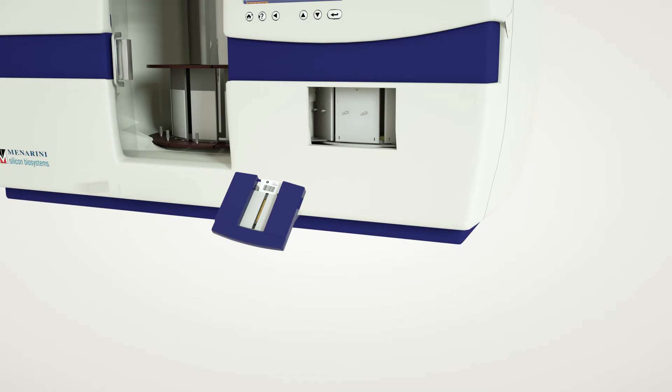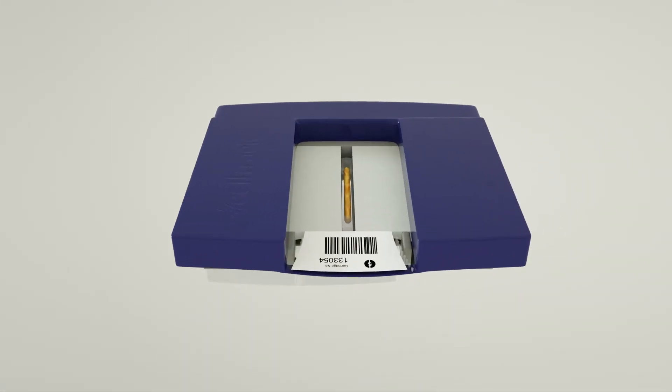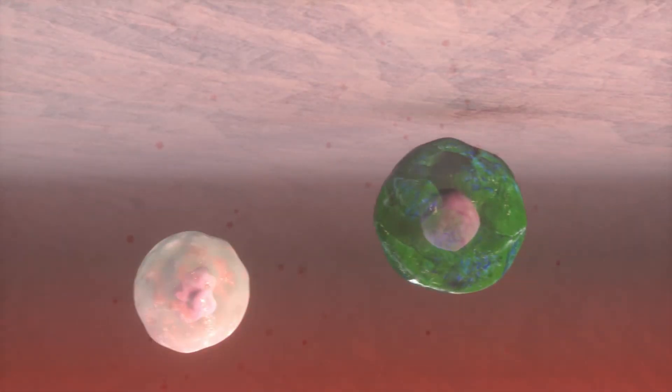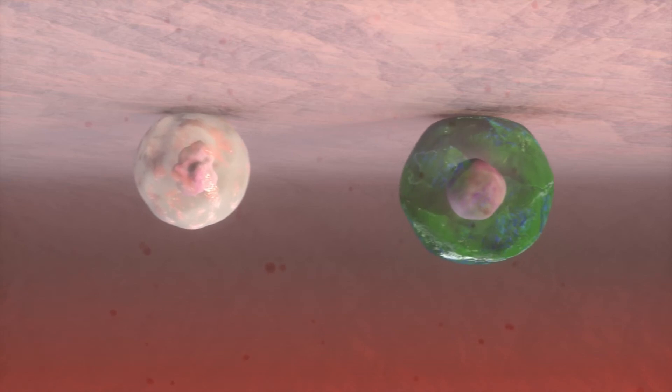The magnet is incubated in the dark for 20 minutes, and during this time, a planar magnetic force pulls the cells to the surface of the cartridge and holds them firmly in place.